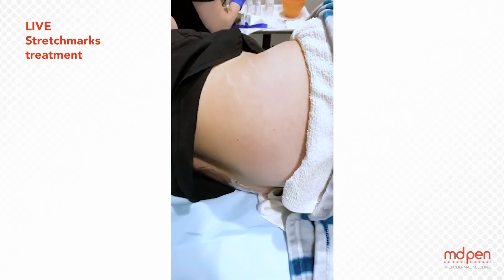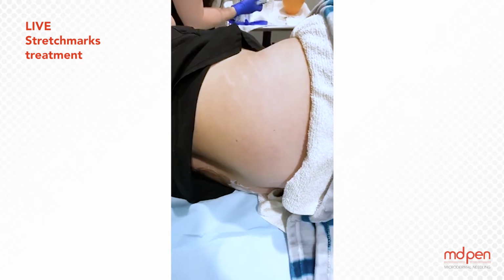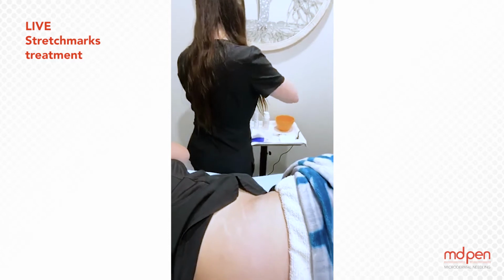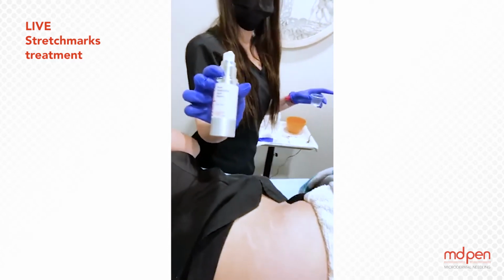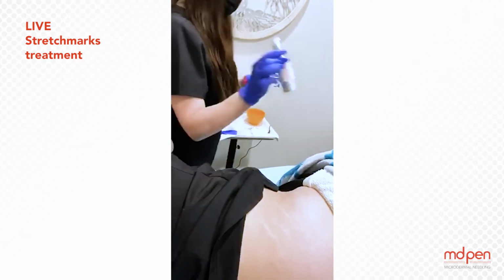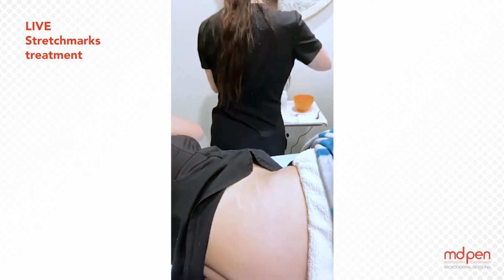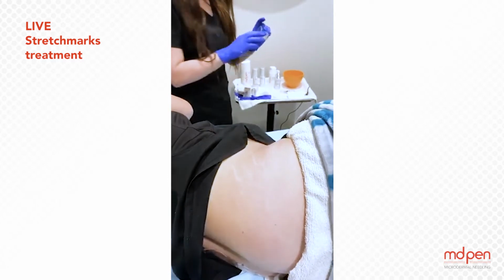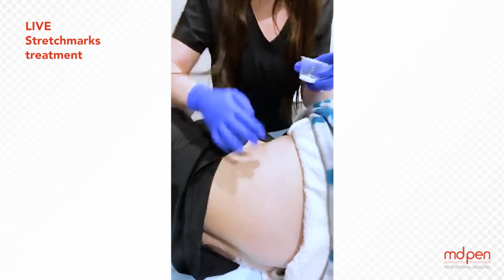I was thinking of using cellular renewal serum on her, but I think I'm just going to go ahead with our regular hyaluronic acid product, HA serum. This is going to be your usual glide. And I've already applied my cartridge.